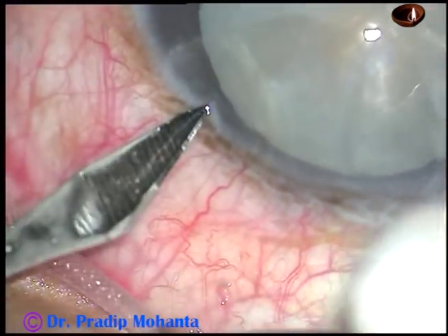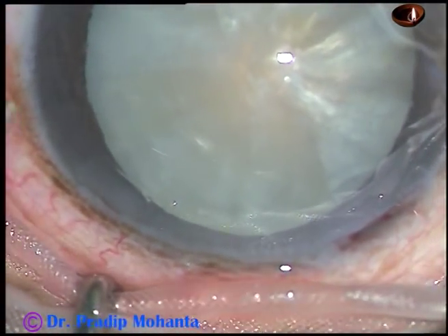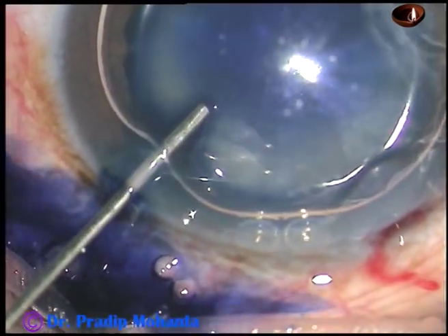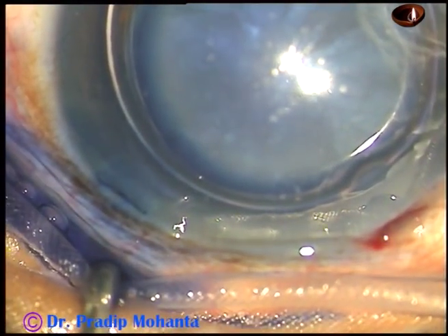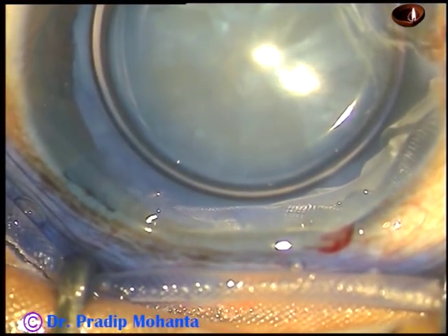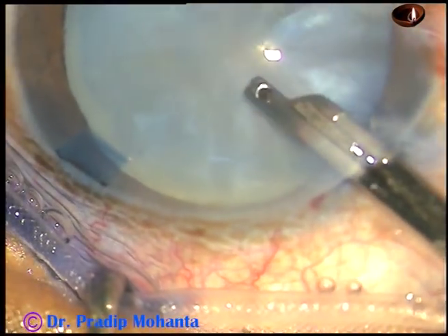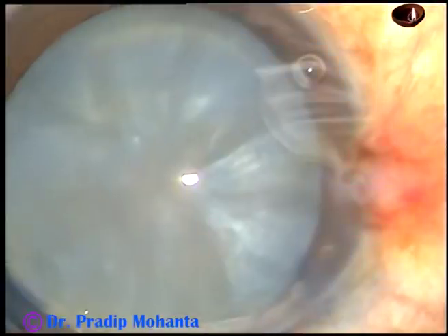We have made the main incision. This is a side port on the left side of the main incision. Now inject an air bubble. Beneath this air bubble, 0.06% trypan blue dye is sprayed over the anterior capsule. The dye should touch at all points of the capsule. You need not wait for 20-30 seconds — immediately afterwards, wash the dye out of the anterior chamber. Enough staining occurs in 5-10 seconds; you need not wait for more than 10 seconds.